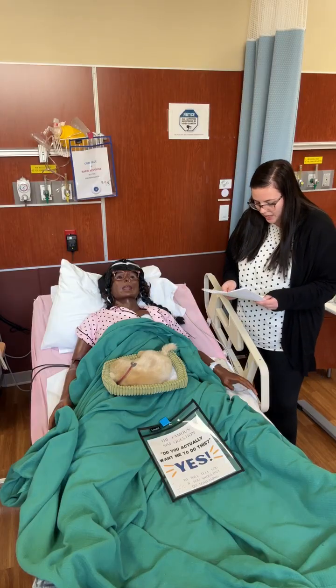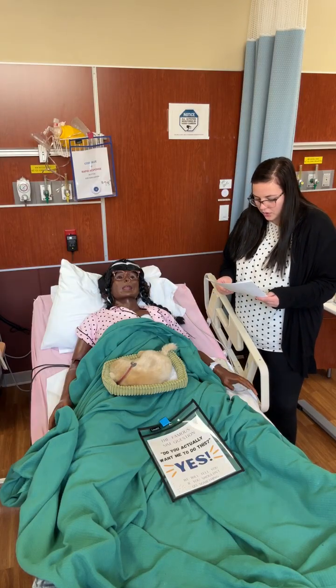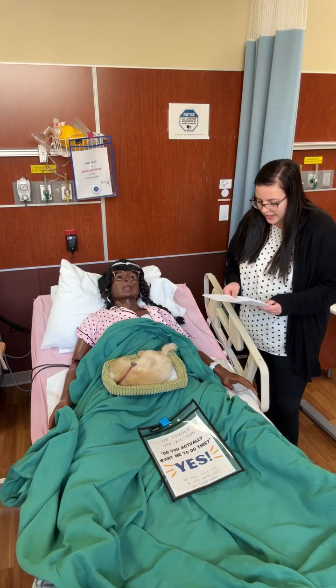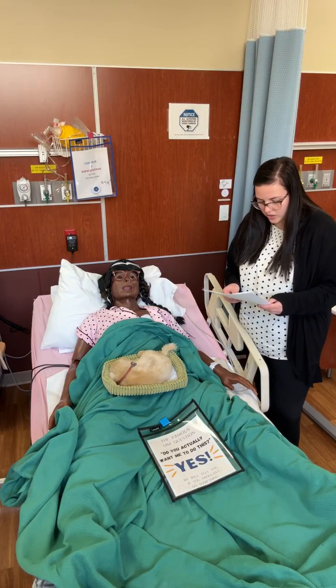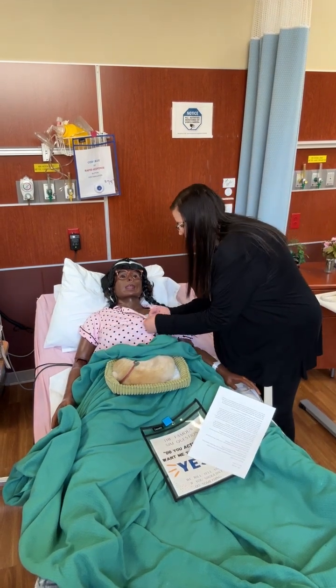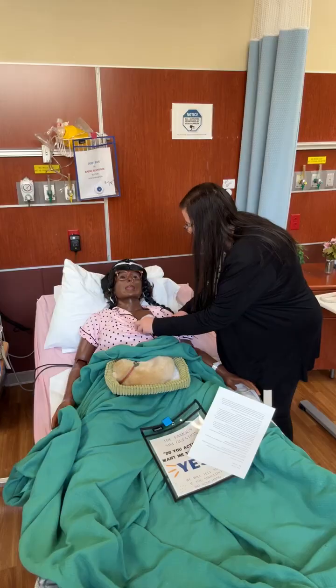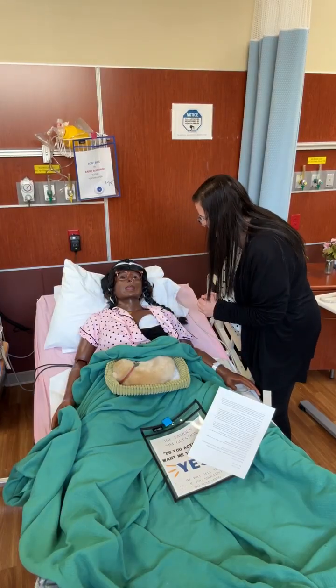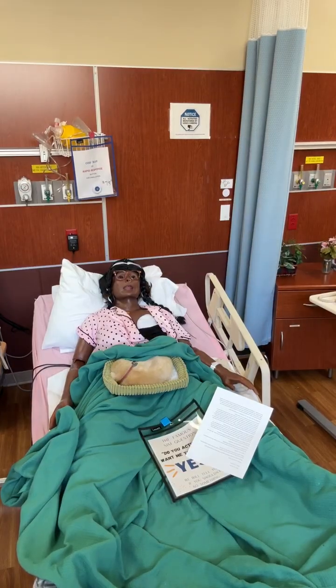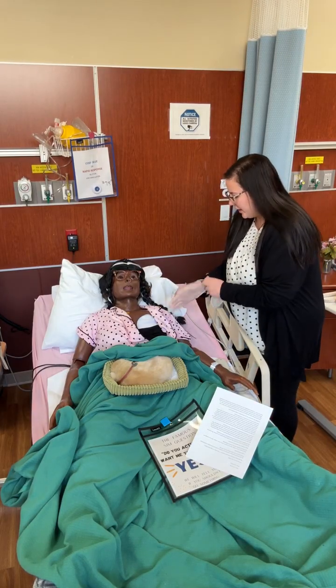To obtain the patient's apical heart rate, you're going to go through the cardiac landmarks and verbalize each location. Once you're ready to count, you're going to find her apical heart tones on the red sticker. So I'm going to show you what that is. When you are ready, you can say, hey Carla, is it okay if I remove your shirt for a second? She'll say yes, and then you're going to grab gloves. So let me grab those. We'll show you where those are in just a second. So always wear gloves when you're touching the simulator.